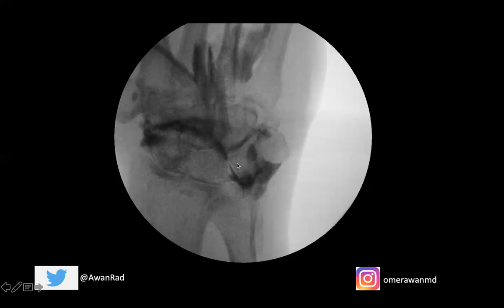What I love about wrist arthrograms is you can often make the diagnosis on the fluoroscopic images themselves. If we did a shoulder arthrogram to evaluate for a labral tear, we almost never see the labral tear on fluoroscopy — we rely on the MRI images. Same thing in the hip. But on the wrist fluoroscopic exam, we can often see the imaging abnormality and the tear on the fluoroscopic images, as we do in this case — we can see frank contrast going through the lunotriquetral interval, suggesting a lunotriquetral tear.